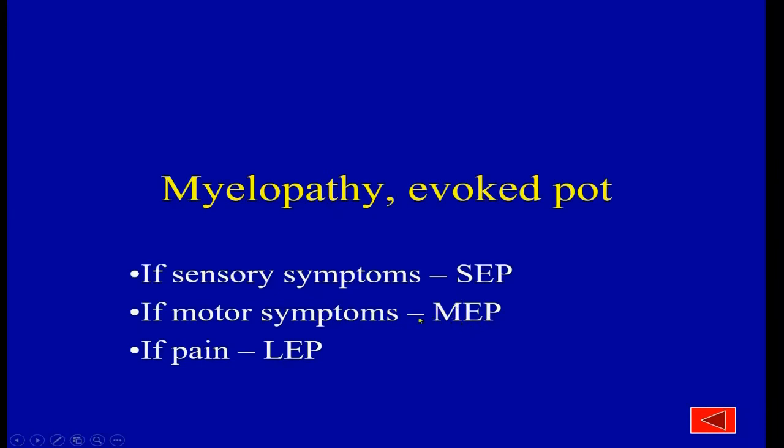And there is a special technique to stimulate pain receptors, laser method, laser evoked potentials, which is not available in many laboratories.